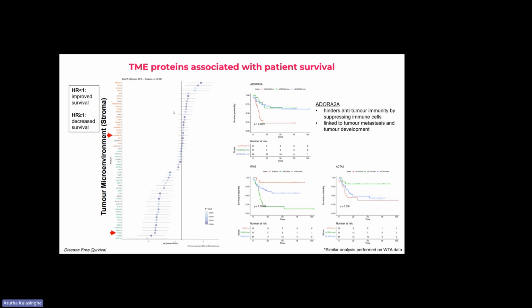So this is just taking a lens of discovery of 580 antibodies and being able to screen across multiple tissue samples and tissue arrays and being able to identify new targets associated with your clinical endpoints. And it was reassuring to see that more known markers and potentially unknown markers were coming up in this screen. And it provides us a framework and a workflow to be able to scale this to immunotherapy cohorts and so on.